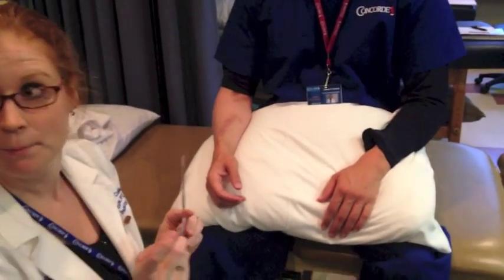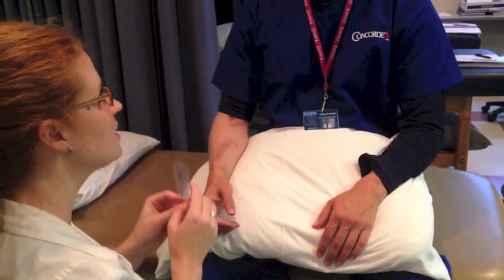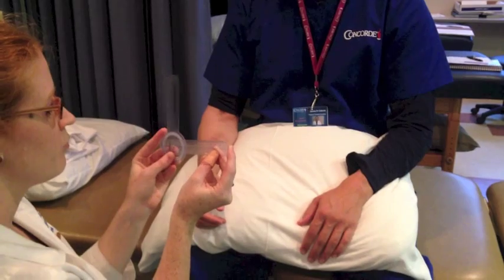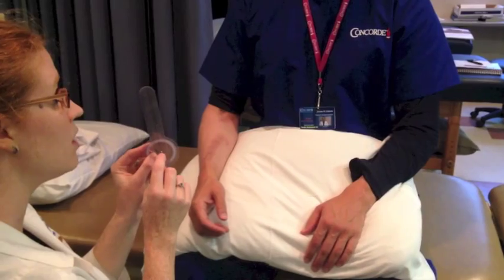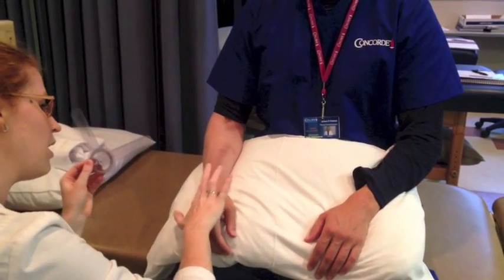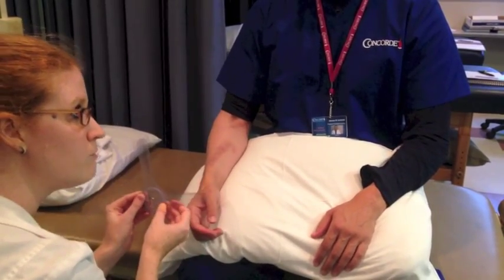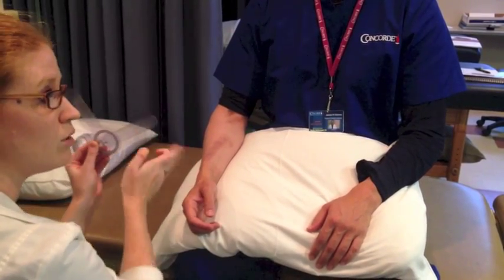Our moving arm — in all the books, they show it directly contacting the patient's skin, but we're going to hover just above. As much as possible, we're going to keep the fulcrum in line with the ulnar styloid. But in order to get the moving arm parallel with the dorsal aspect of the forearm for pronation, or the palmar aspect for supination, the fulcrum is actually going to come up a little bit, and that's okay as long as you keep it in line with the ulnar styloid.